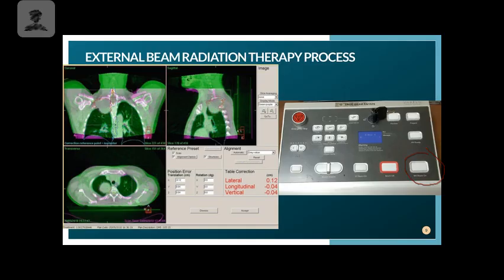So definitely don't want to have that occur. So it gives you those last minute things. If you ever have an issue where you're like, oh my gosh, we need to stop, emergency stop is right there. So hit that quickly. The only thing that stinks is it kind of shuts down your machine a little bit, not completely off, but pretty darn close. So it's going to take a little bit for it to come back up. So unless it's an emergency, don't hit that.